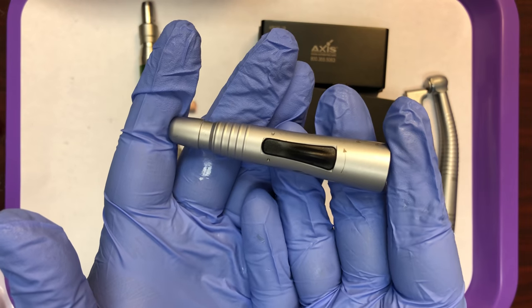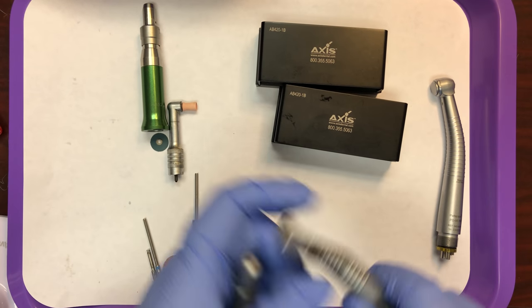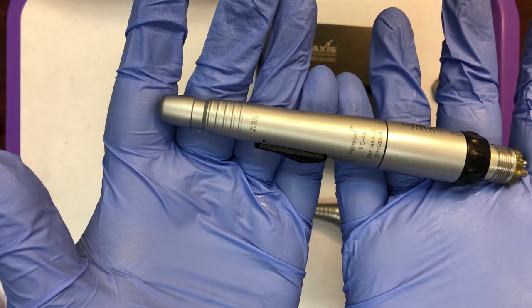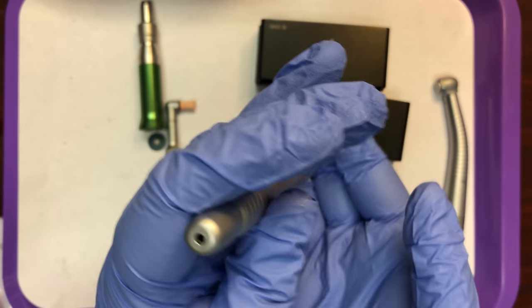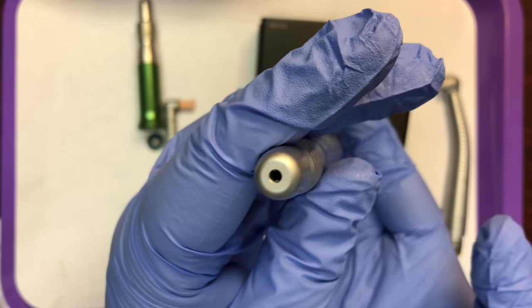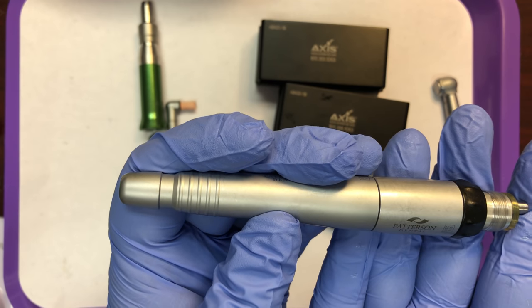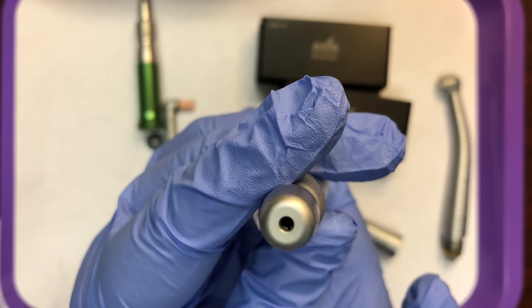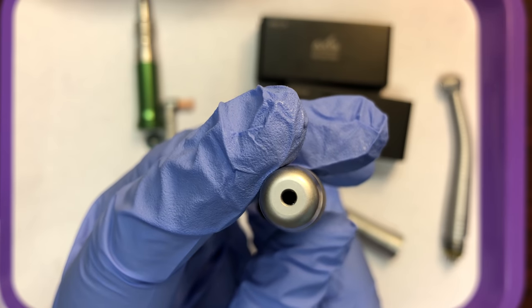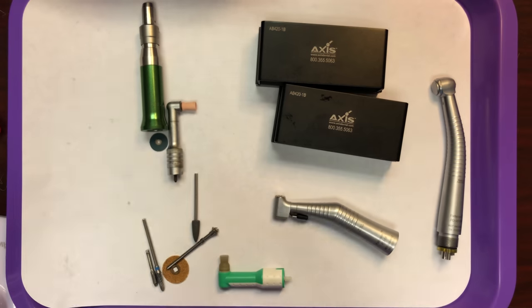This next attachment is a straight attachment. This also gets attached to the low speed motor. Unless you have two motors on your setup, you can only use one at a time, but you can switch them out very easily. The only burrs that will fit into this large opening are your straight attachment burrs. Anything else — latch style and friction grip — are too small; they will actually fall right into the opening.